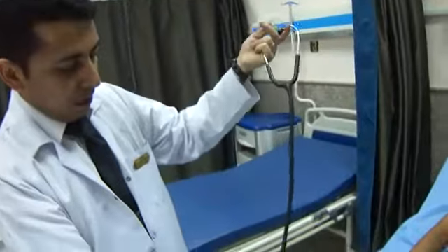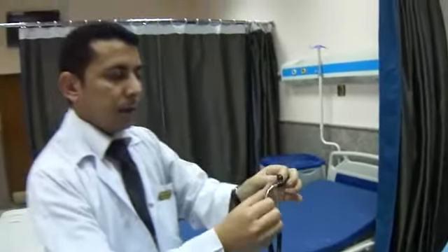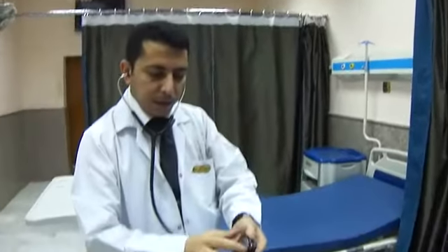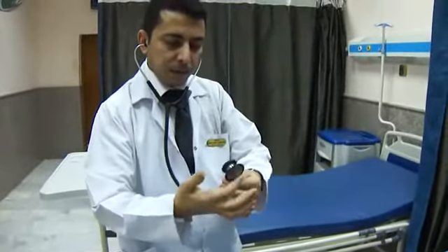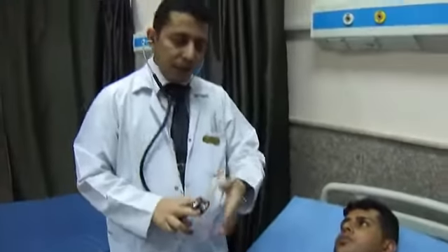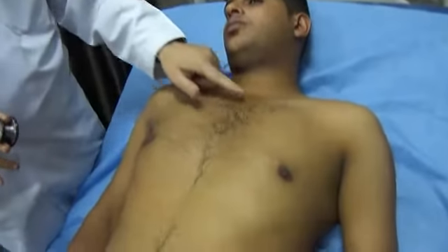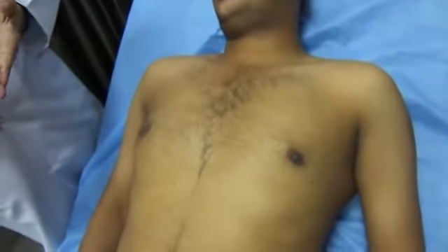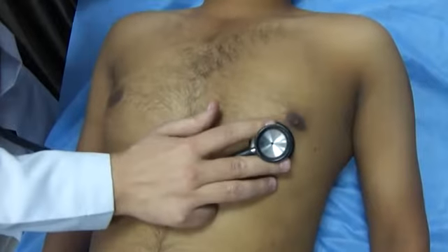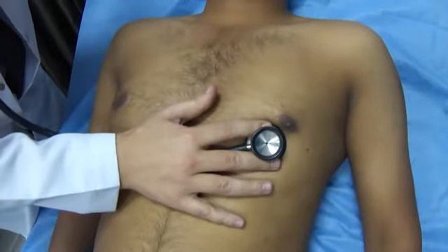Both tubes, or this single tube, should not have any tearing or any cracking. In such a manner, I'll put the stethoscope here and I'll check it, whether the diaphragm or the bell. Okay, I'll listen over the cardiac area, starting from the mitral area, then tricuspid area, pulmonary area, and lastly at the aortic area, and asking the patient to hold the breathing if I heard any abnormality in such a manner.